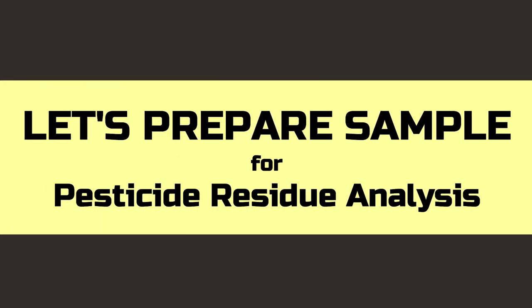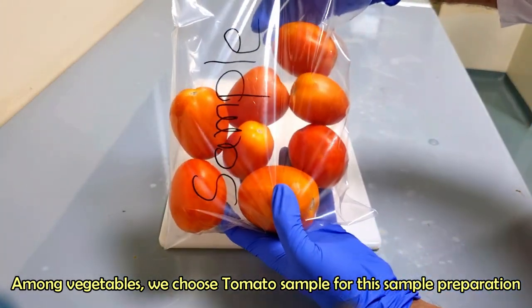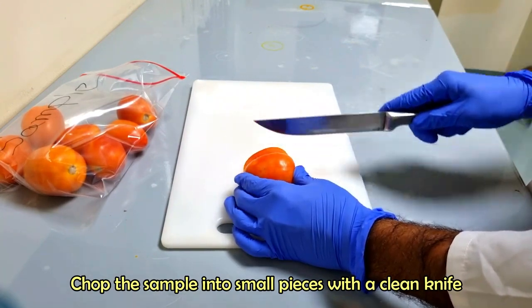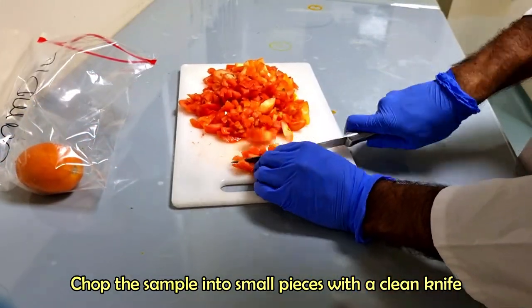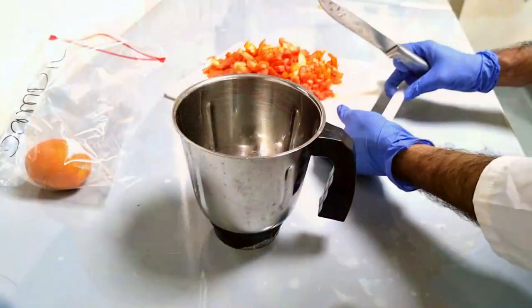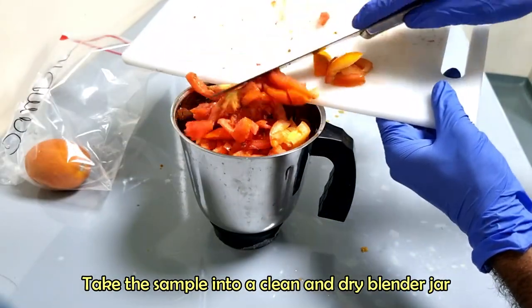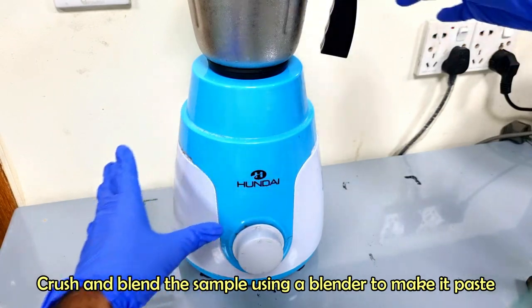Let's prepare the sample for pesticide residue analysis. Among vegetables, we choose a tomato sample for preparation. Take some homogeneous portion of the test sample and chop it into small pieces with a clean knife. Crush and blend the sample using a blender to make it a paste.